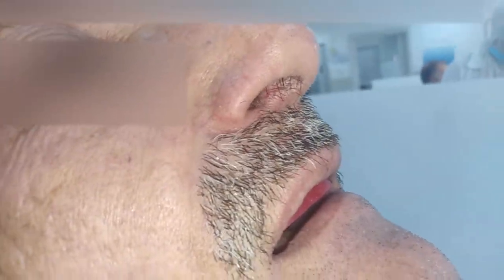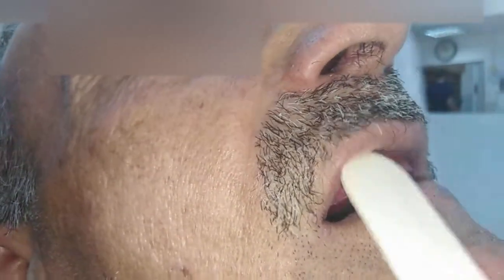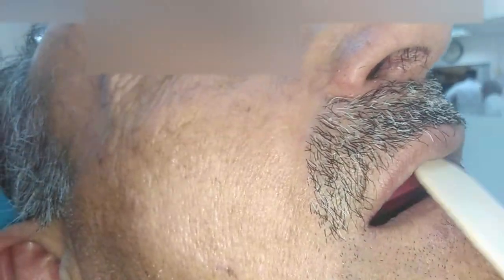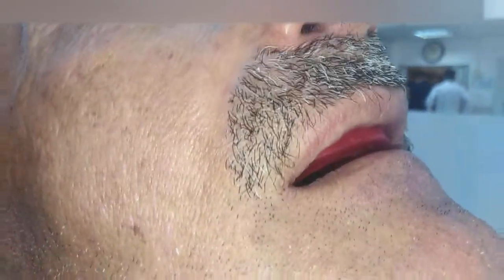There is no 90 degrees between the nose and the lip. But to further diagnose and confirm it, we tell the patient to speak, and you will see that the active lip elevates in another way and you begin to see empty spaces in between. It's not sliding over the wax — it's actually going away from it while he's speaking.